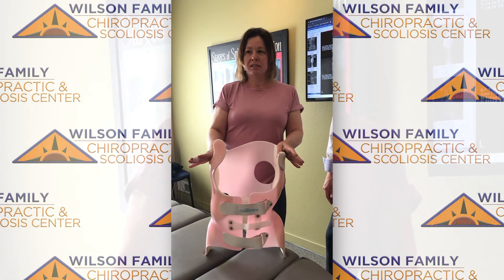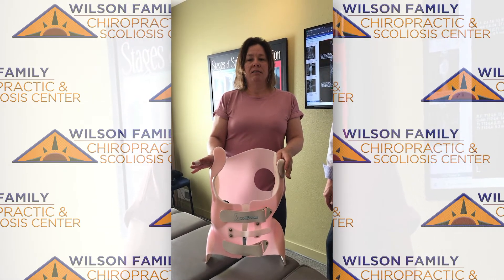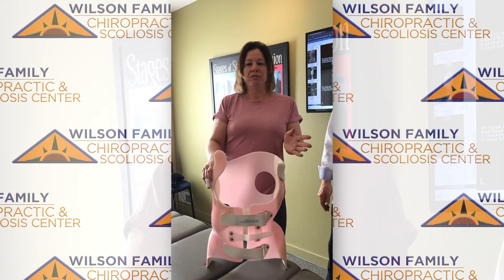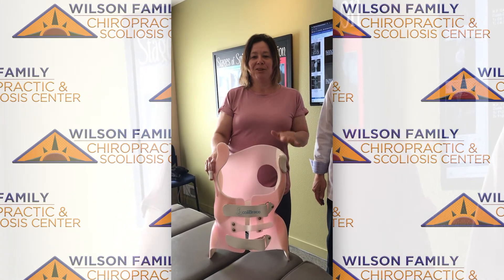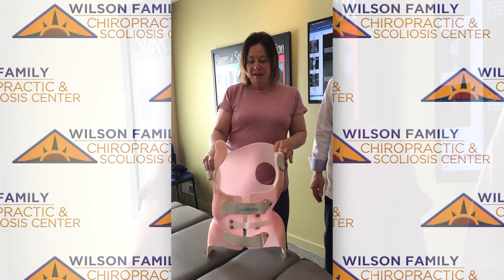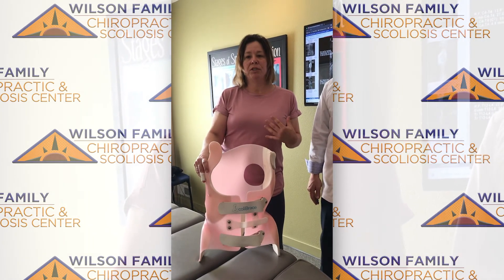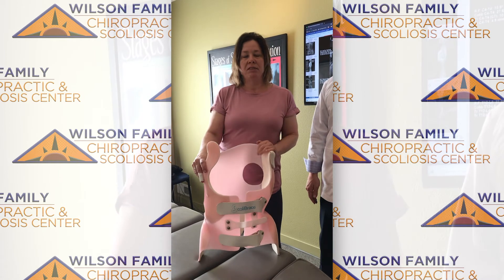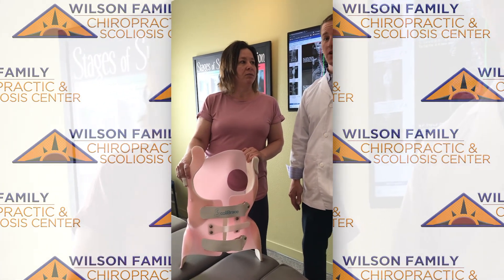I got this December 15th and it took me about three months, and after that I was almost pain-free, and now at five months I'm totally pain-free. So it's well worth the wait, just push through it. It's going to be uncomfortable at first, but it will form to your body — I would say within three to four weeks.